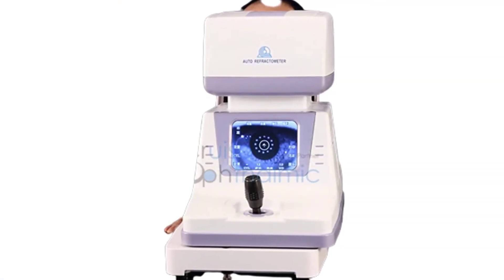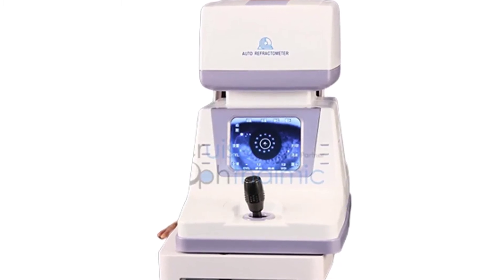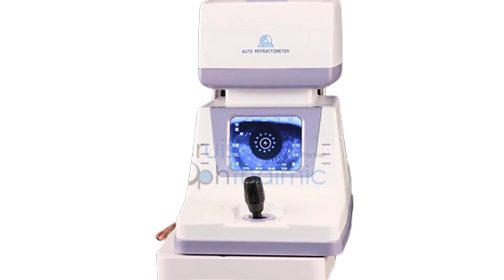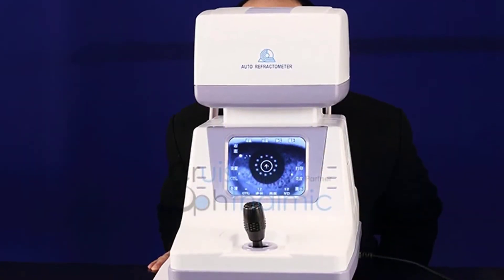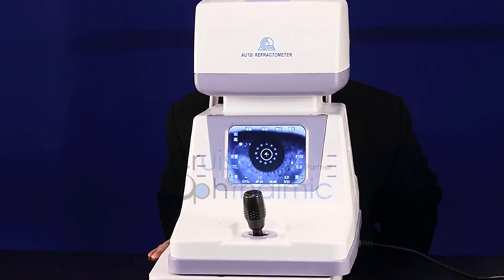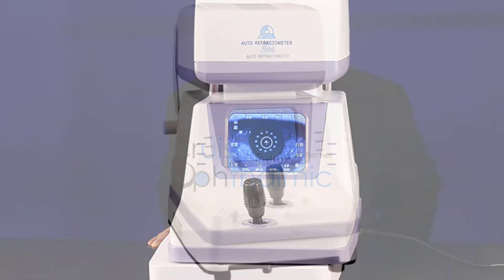The instrument can automatically measure the refractive power of the eye, which is convenient, fast, and accurate. Specially designed for the African market, the high-resolution LCD display autorefractometer is a pocket-sized and very portable device with a large angle compensation capability, and is perfect for the Africa market.